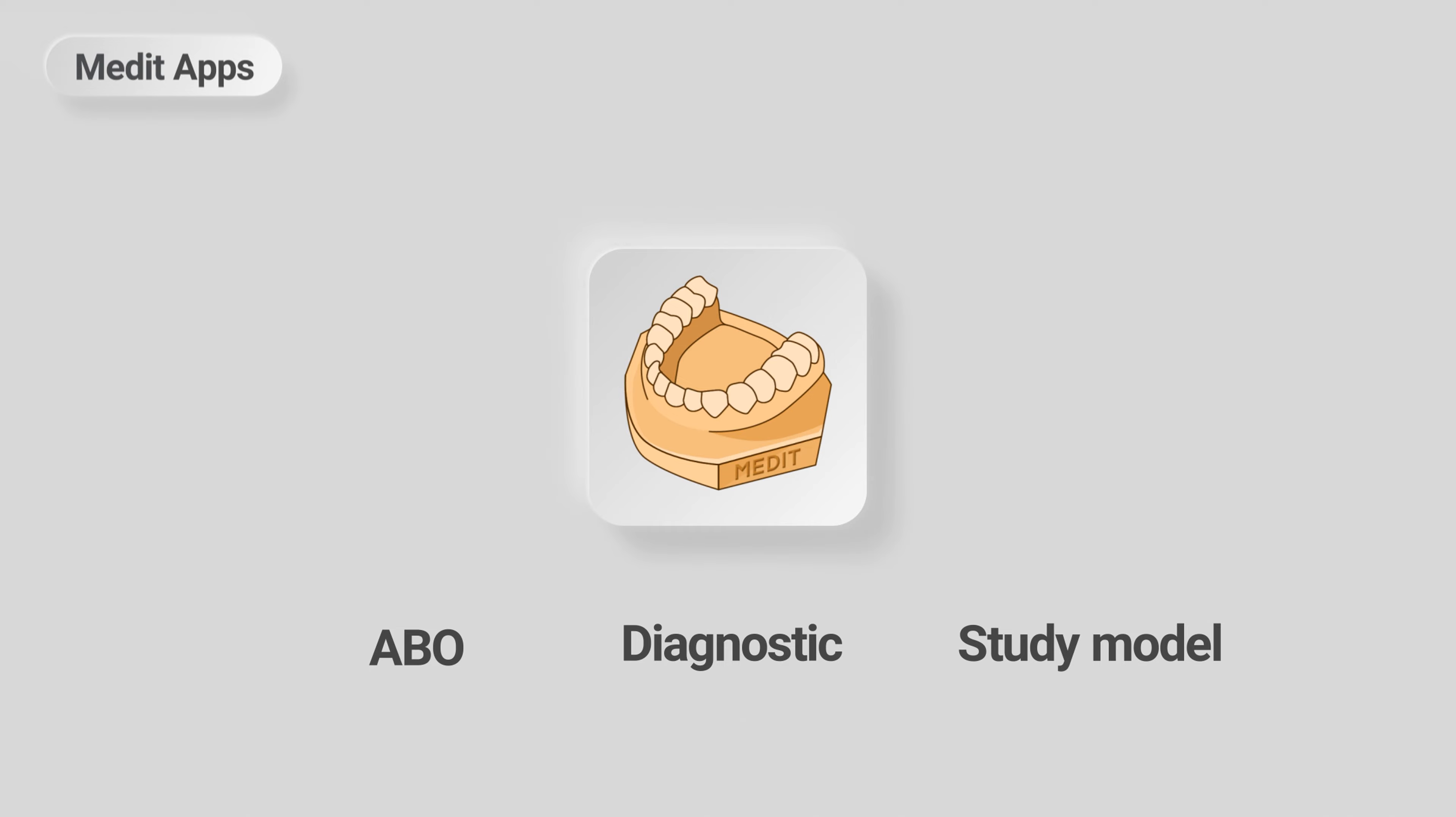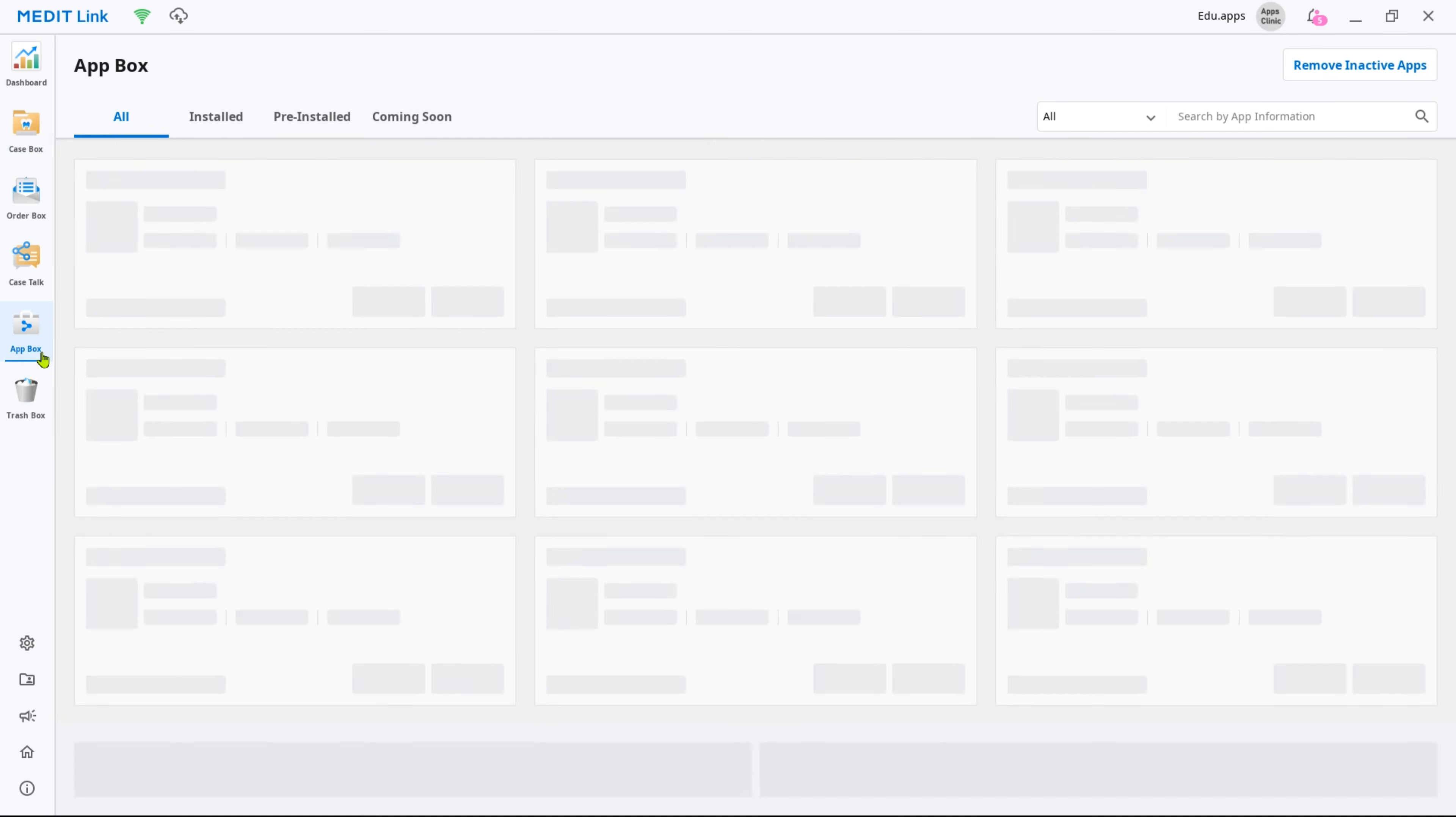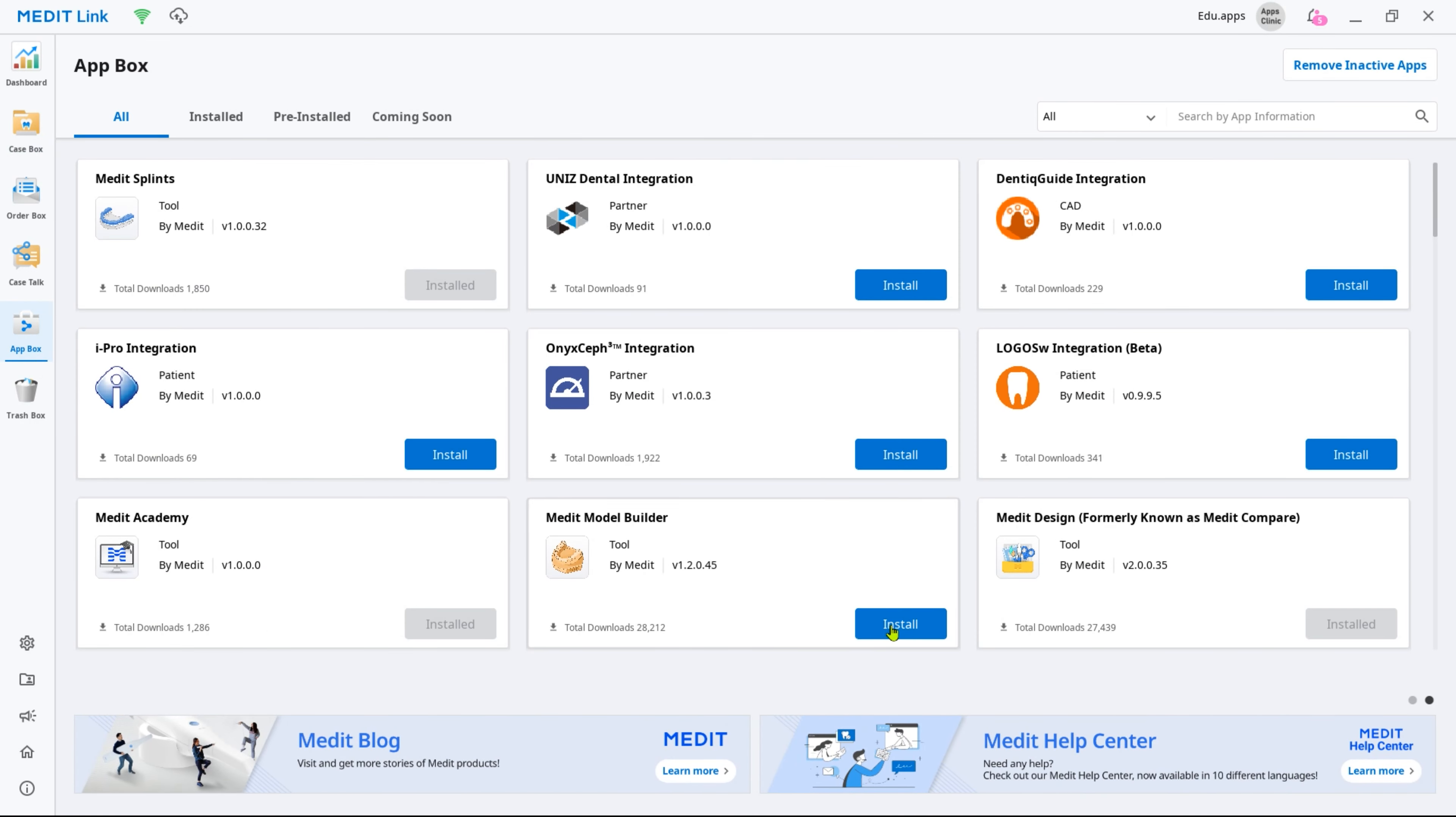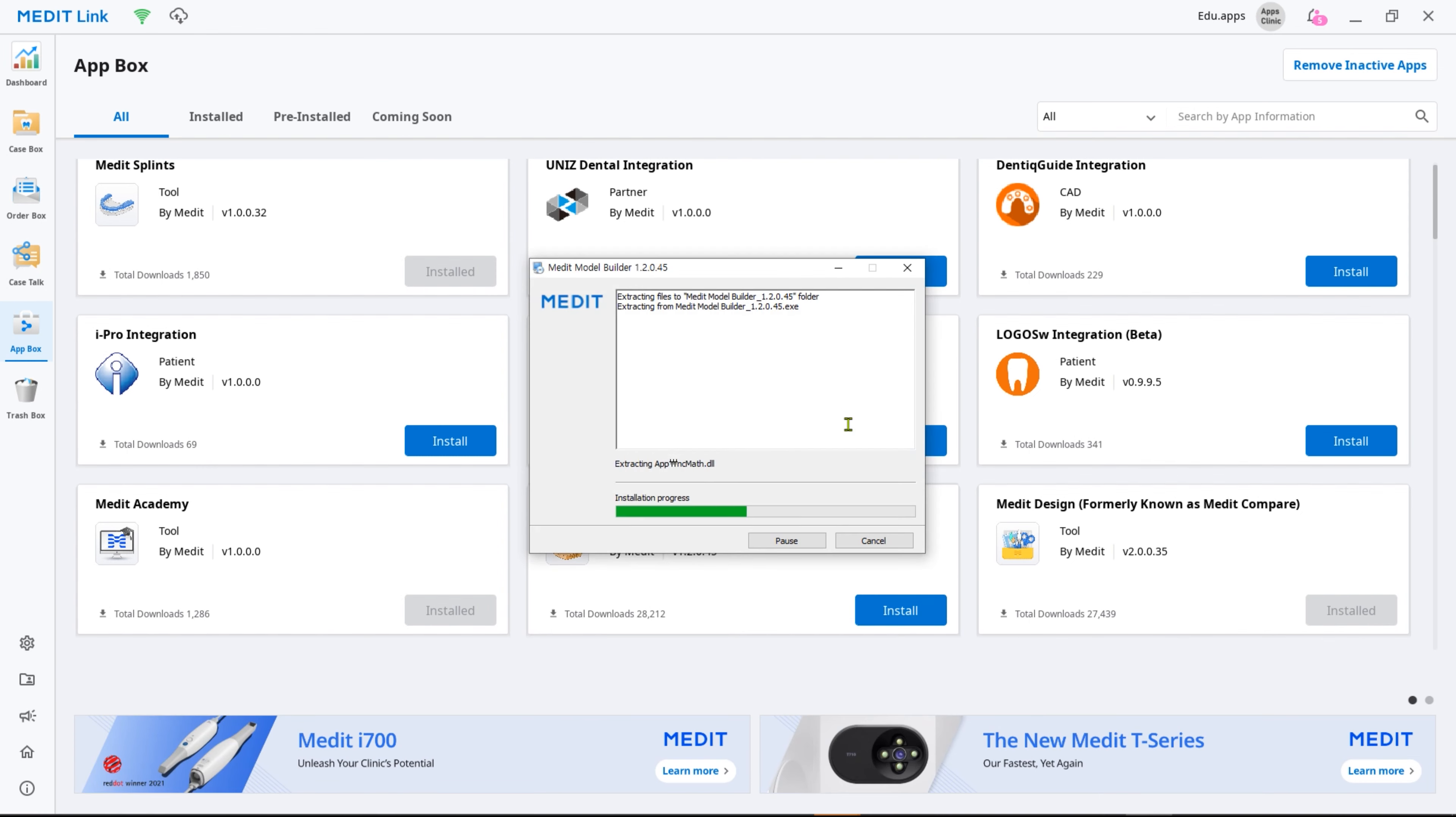First, let's install the app. Log into your MeditLink account and go to App Box. Then find Model Builder and click Install. The installer will run automatically.